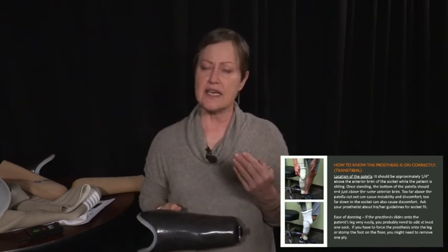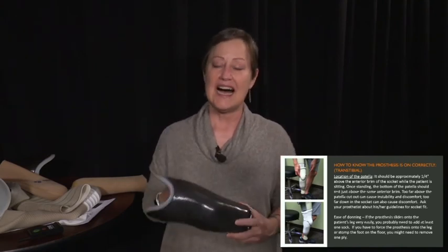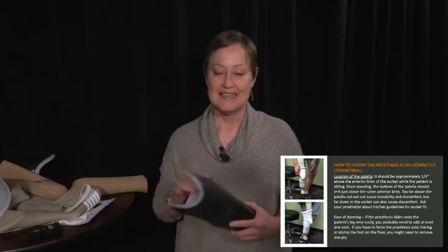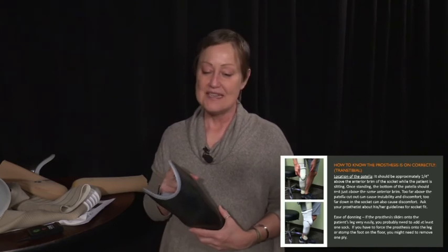People tend to think early on, socks provide cushion. Therefore, if I have pain, I need more cushion. Therefore, I will add more socks. And then they kind of go crazy and they end up all over the place. And sometimes the answer, instead of adding socks, is to take socks away. I have run into that on several occasions with patients, and I've missed the boat, and the prosthetist had to call me up and say, hey, this is what's going on.